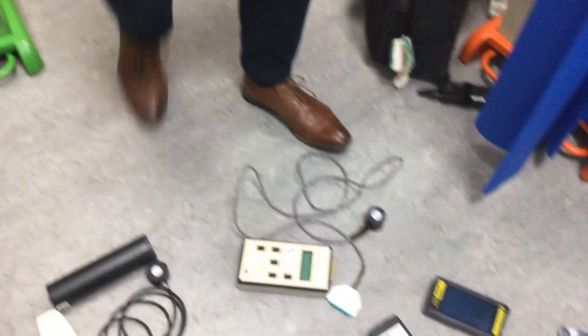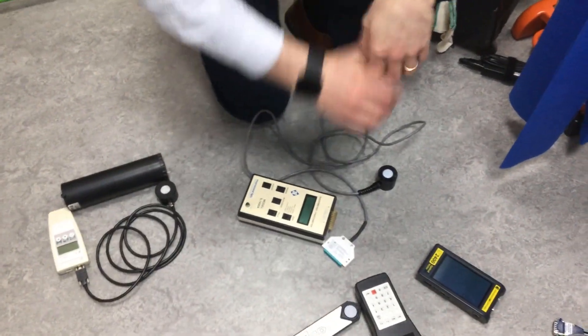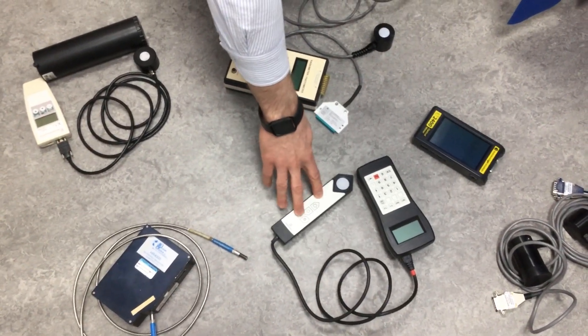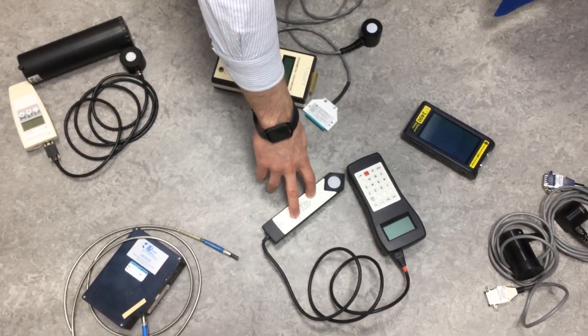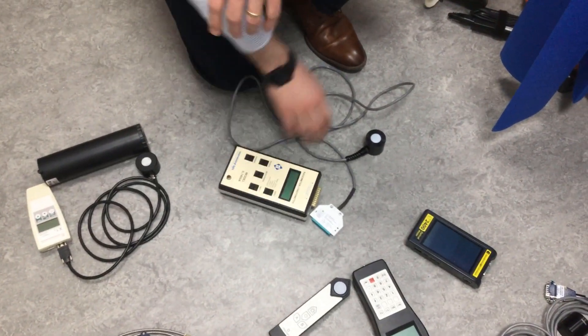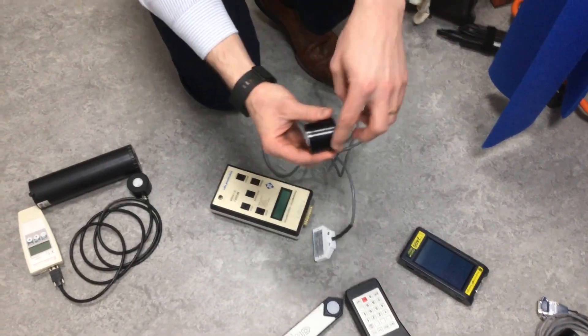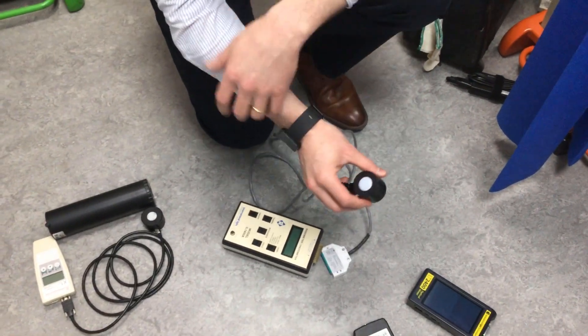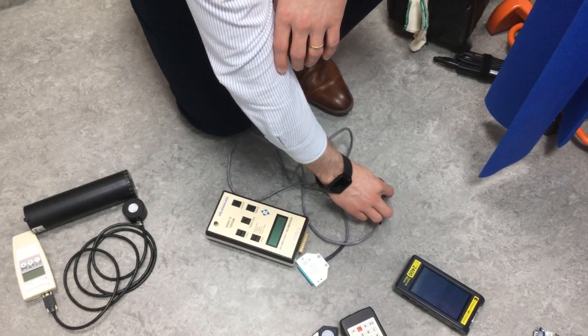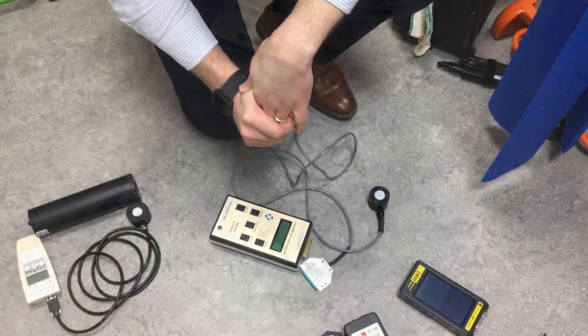Some other available systems on the market: you have the Waldmann unit here, which measures both UVA and UVB. For the International Light systems, you'll often have different detector, filter, and diffuser combinations depending on the type of UV or visible radiation that you're measuring.